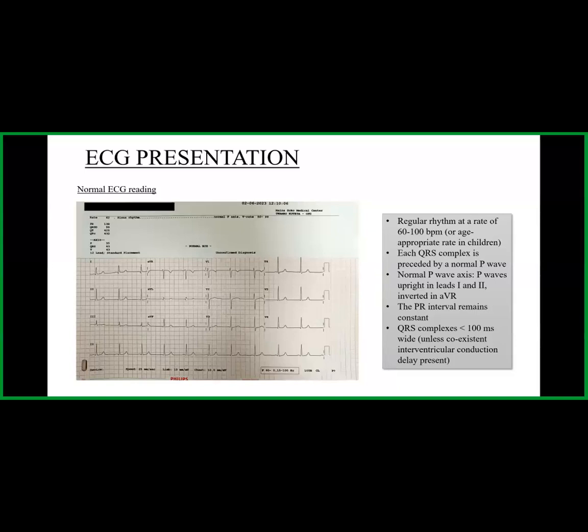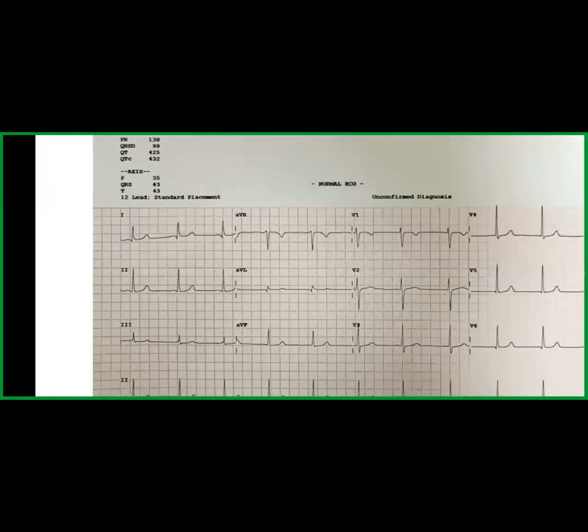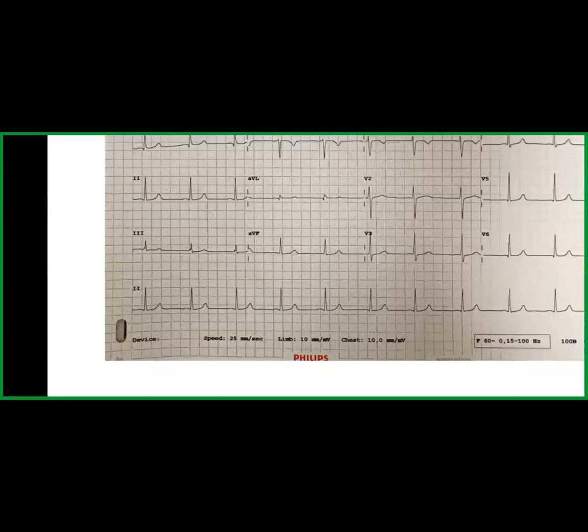Second to that, we will see that each QRS complex, which is the sharp wave that we are seeing at the beginning here. If we look at lead 2, we can see these sharp waves at the top here, and these are called QRS waves. In a normal individual, each QRS complex has the same distance between one and the other.